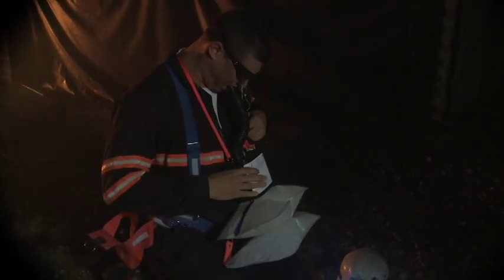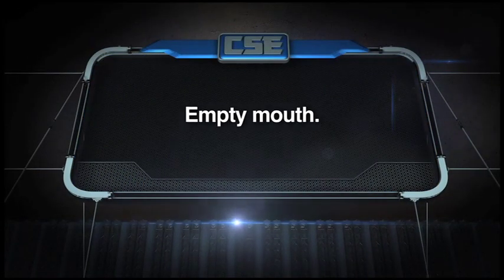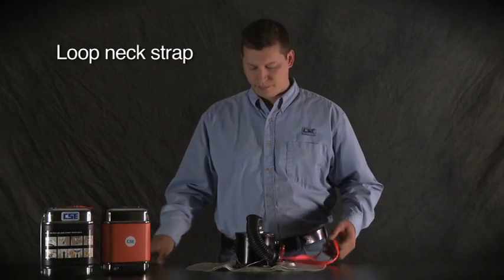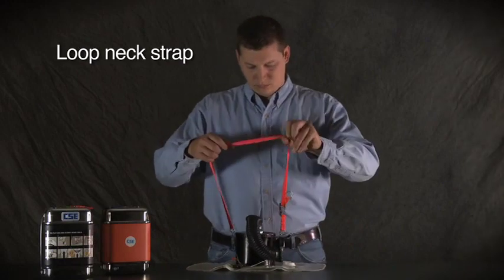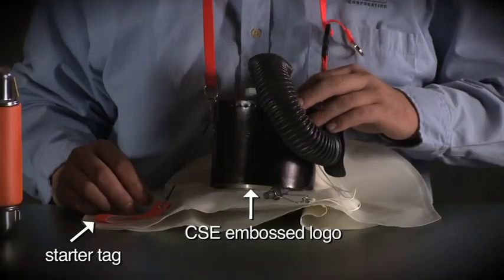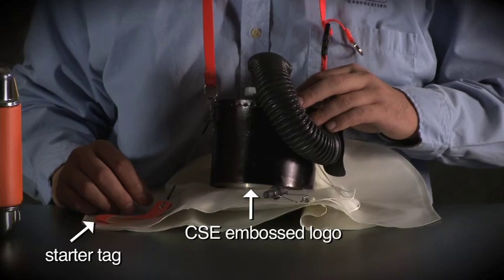Here's how to practice the manual start with the SRT. First, empty your mouth of chewing gum, tobacco, or anything else that could block your mouthpiece or cause you to choke. Loop the neck strap over your head. Make sure the CSE logo on the case is facing away from you and the starter tag is next to your right hand.